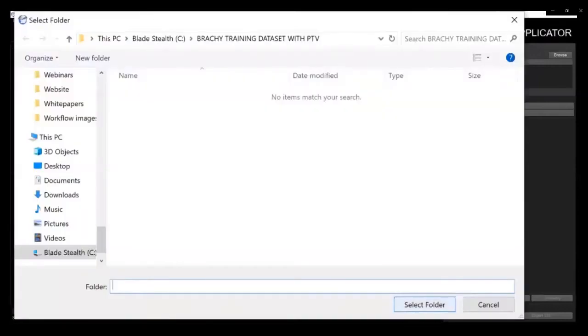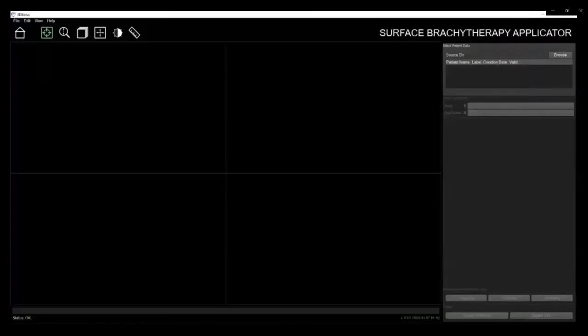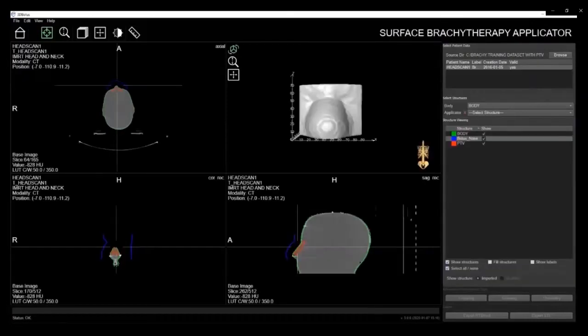Software uses the TPS to gather the necessary patient data that is required. Certain patient information will populate in the top right of the screen. Additional patient info will appear by hovering your cursor over the patient name. This allows you to ensure the correct data was imported.